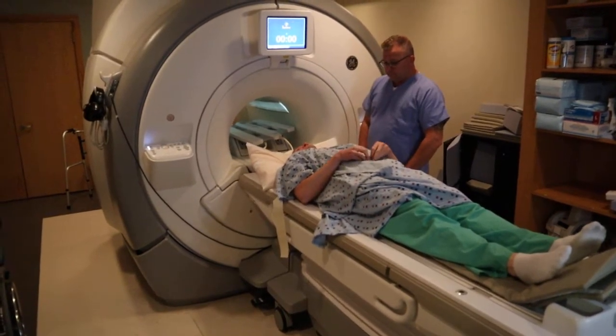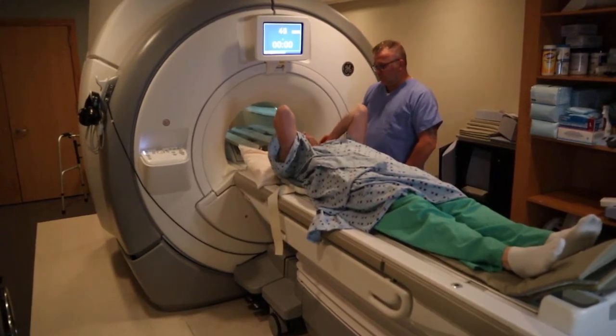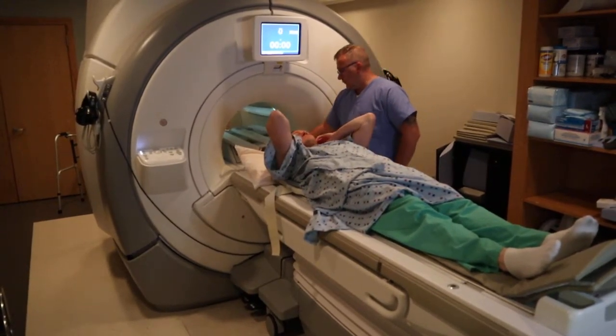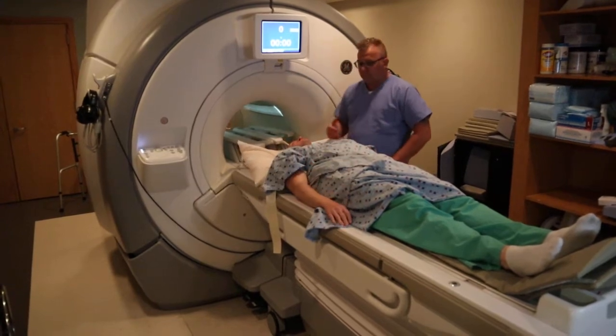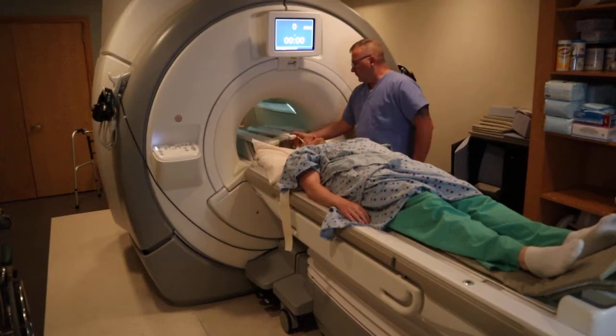For the brachial plexus, if it's a unilateral study, which is only one side — so for example, if we're scanning the right side, you would want to shift the patient to the left side for that right side to be center of the coil, and vice versa.